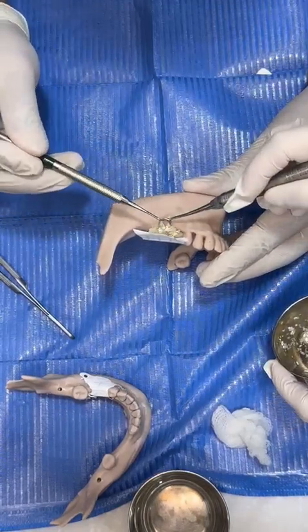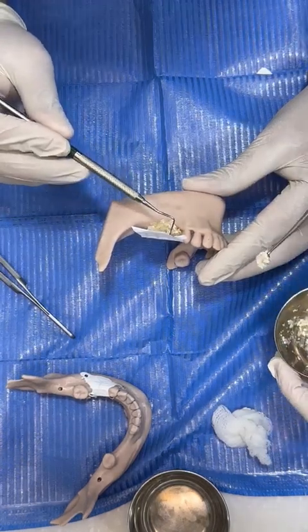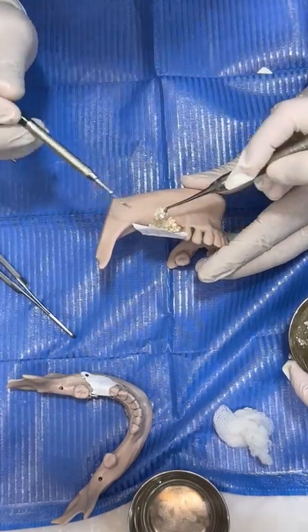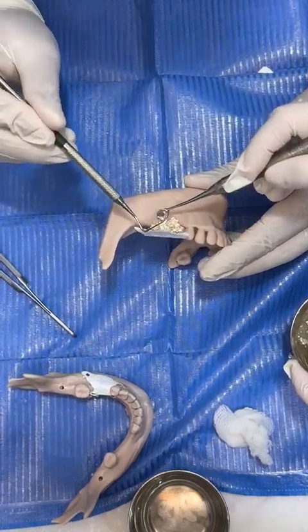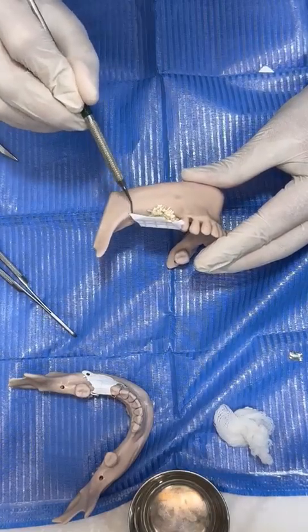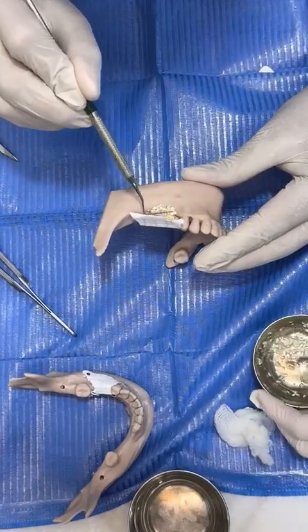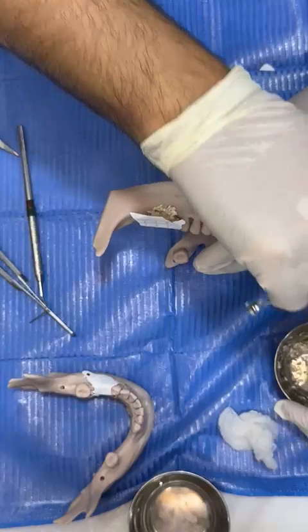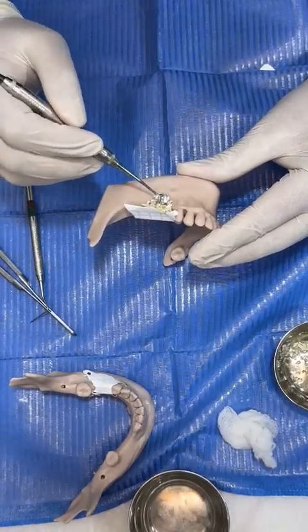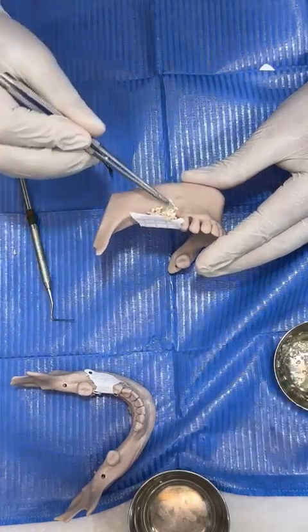Before the next screw, you should make sure that you are covering the crest of the ridge because you are doing vertical augmentation and some part of the horizontal augmentation. Okay. This is good for now. I will check. Give me this, please. Okay, let's check now.